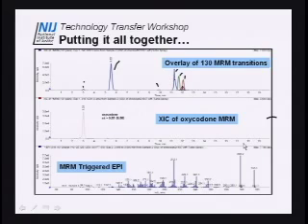The second panel is an extracted ion chromatogram of just oxycodone. You get a pretty good idea of its retention time by looking at this. Here, there's 3.02. What you see here is me calculating the relative retention time to mepivacaine. Remember I told you yesterday we put mepivacaine in everything we can think of. We haven't quite got it in my coffee yet, but I'm sure we will someday.